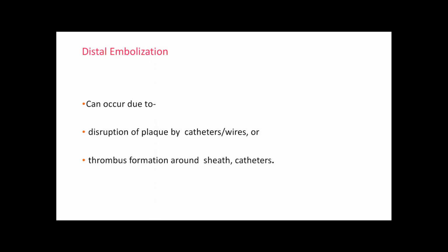Likewise, distal embolization is very common. Most of them are not detected, but sometimes the thrombus or the atherosclerotic plaque can go distally. Most of the time they are benign, but sometimes they can manifest as livedo reticularis, a mottled appearance of the foot. Most of the time you can just put the patient on heparin, or if you find that a significant vessel is involved, anterior tibial or posterior tibial, you can put in a wire and dilate it and treat it if you think that it's a major vessel involvement. Otherwise, if it's a small vessel, you can just leave it like that and it will self-heal.